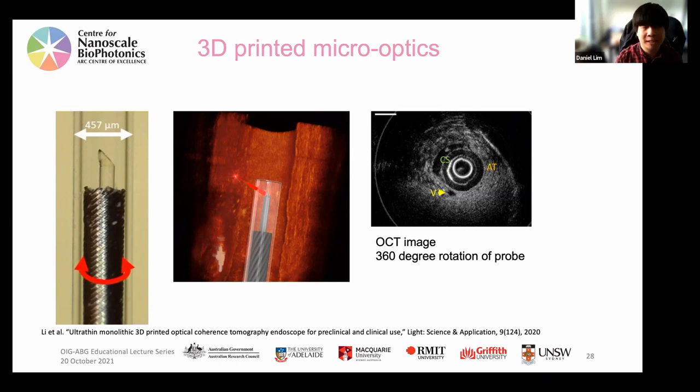So I guess it's quite matched to the refractive index of the glass there to avoid aberrations. Yes, and there are different refractive indexes that they can use in these photoresists, because optics is just one of the applications they're looking at with this sort of multi-photon lithography. There are a whole lot of other things in 3D printing, but for me, it's the optics potential. So they certainly have photoresists that are really good for optics, but they have other ones which are not optics based as well.